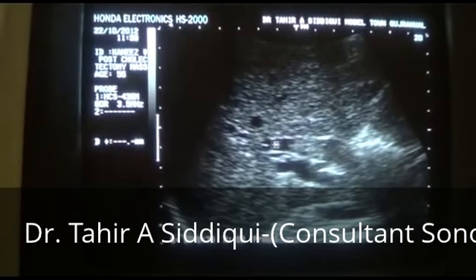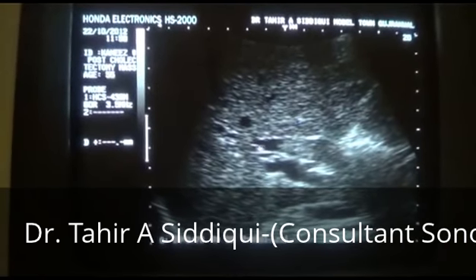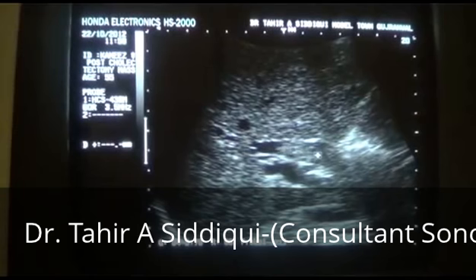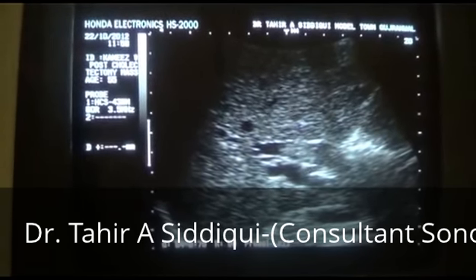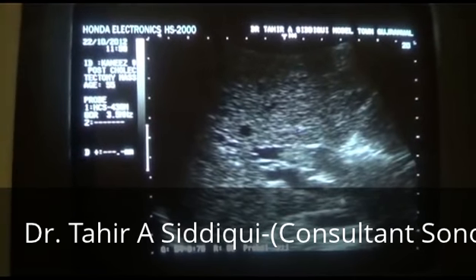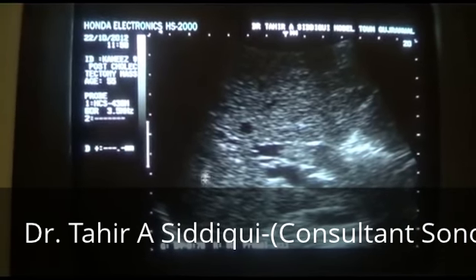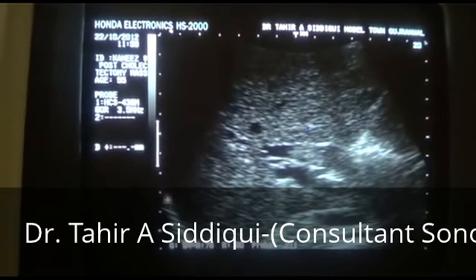Again, this is the clear lumen of the common bile duct. Here the common bile duct is dilated and is filled with thick echogenic material. This is the hepatic artery in transverse section. This is the portal vein, and this is the IVC in transverse section. This is the liver, early stage cirrhotic liver, the part of the diaphragm.